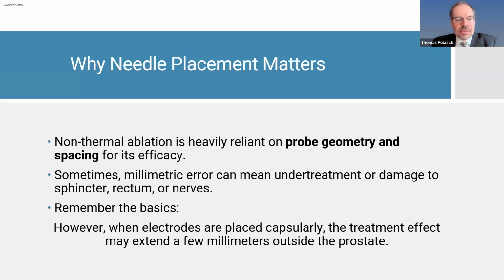But remember that with ultrasounds today and imaging, it's very easy to see these electrodes. You can put them exactly where you want them. You can measure them and get your treatment effect. Now, if you do put the electrodes on the capsule, you will have some treatment effect a few millimeters outside of the capsule. I know that most of the time we're treating tumors within the capsule, but there are instances where you want that energy to extend a little bit beyond.